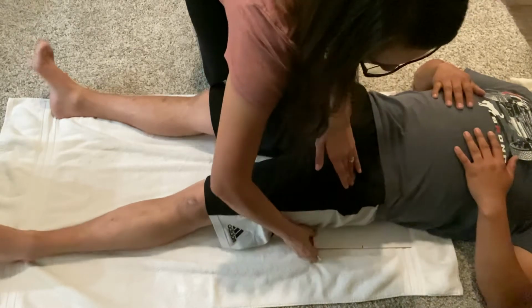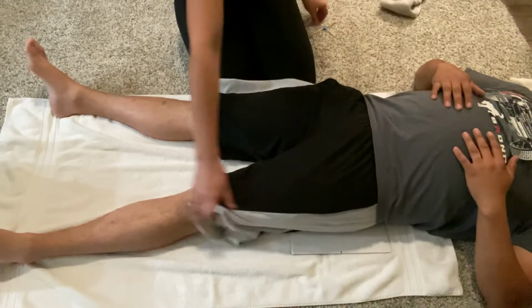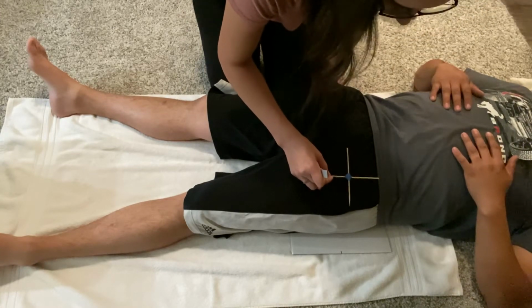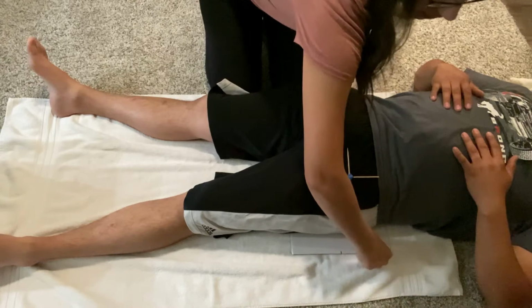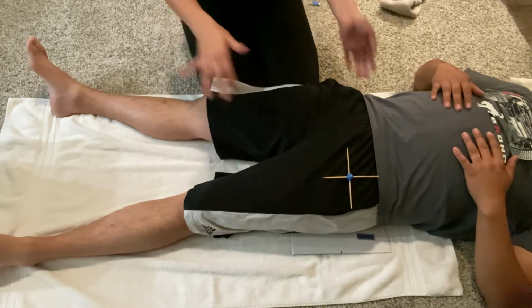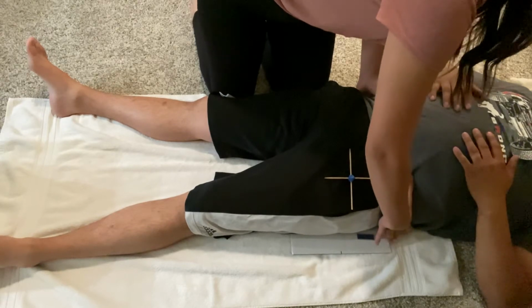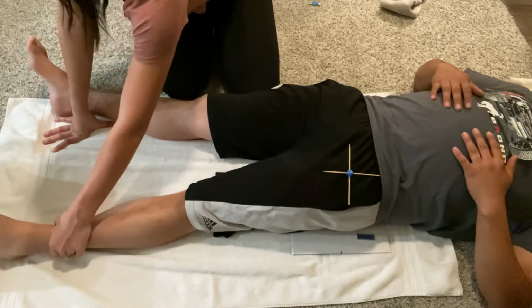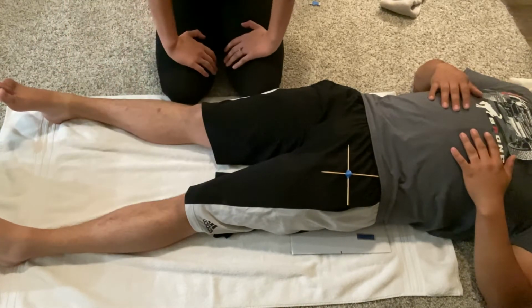So I'm gonna bring this down a smidge. Okay. And your central ray should be centered to the femoral neck as well. It won't stay. For this exam, we should also make sure that there is no rotation by checking the distance from the ASIS to the tabletop. That should feel centered. The legs should be medially rotated 15 to 20 degrees, and this places the femoral necks parallel to the IR.